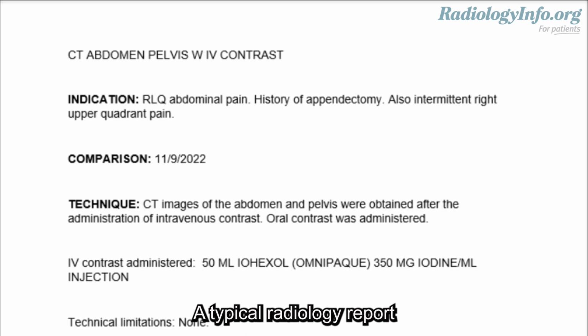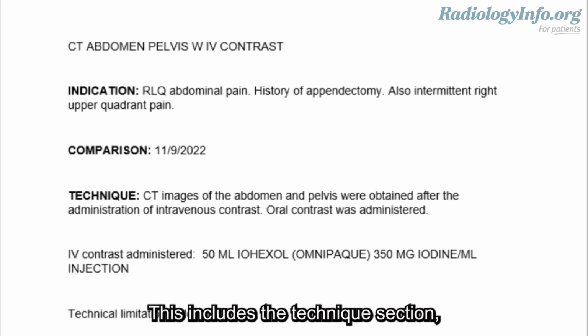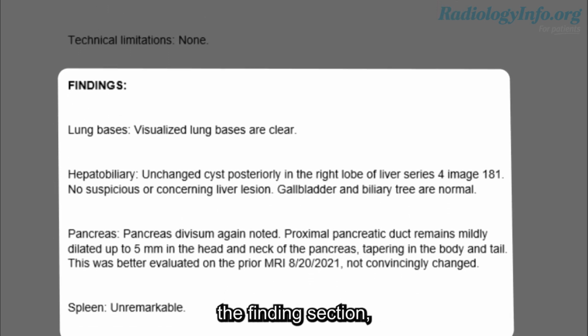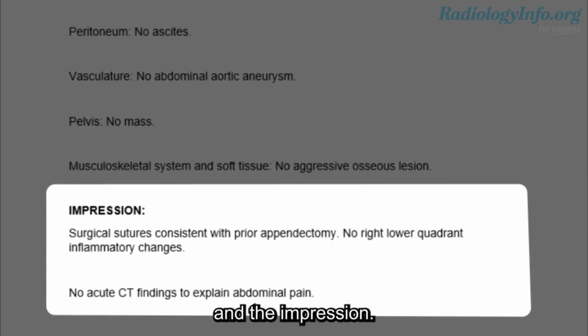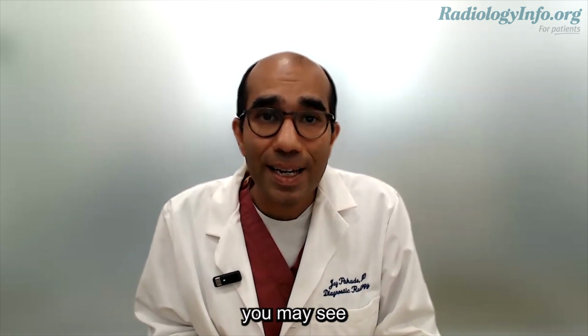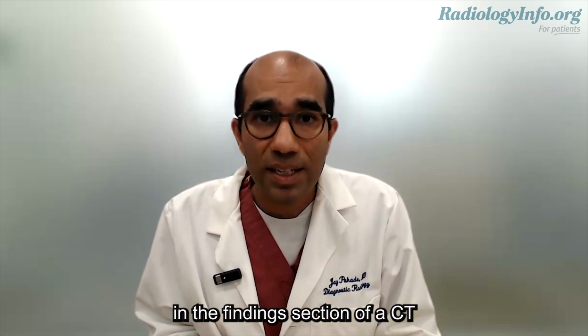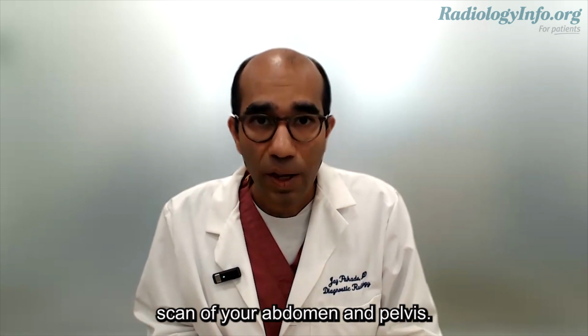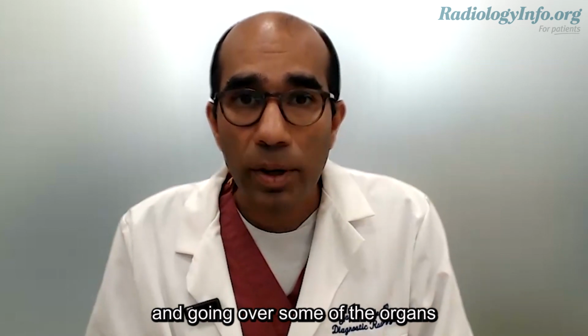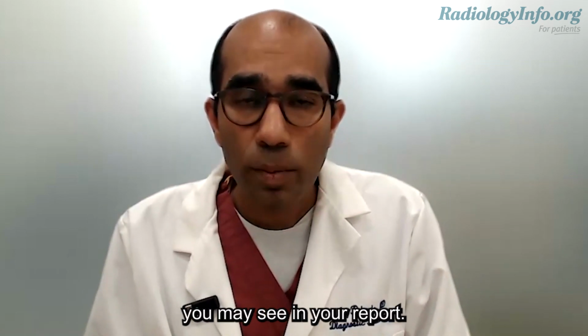A typical radiology report will have various sections. This includes the technique section, the findings section, and the impression. In this video, I'm going to focus on typical things you may see in the findings section of a CT scan of your abdomen and pelvis. I'm going to do this by scrolling through an actual CAT scan and going over some of the organs and some of the terminology you may see in your report.